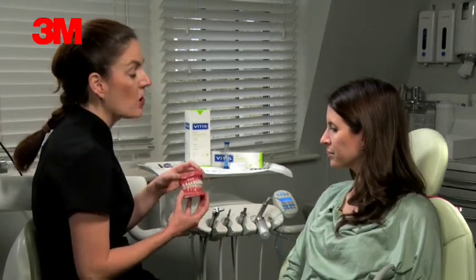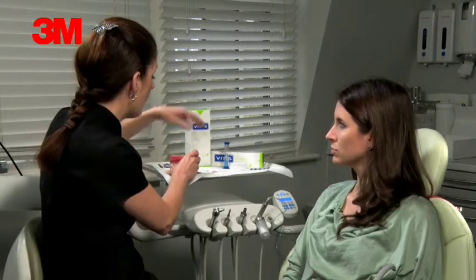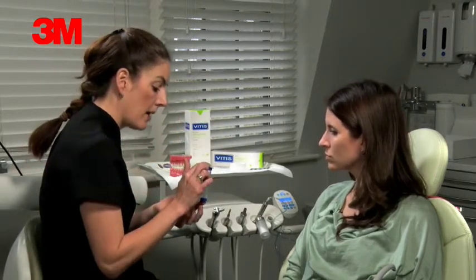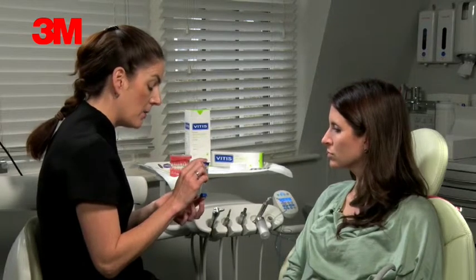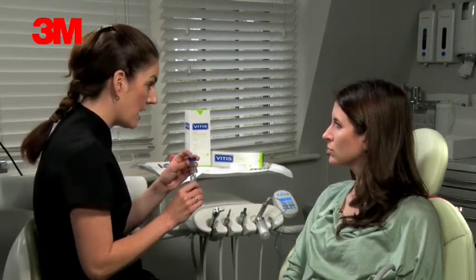It's actually going to take you longer to clean it now because there's a few more nooks and crannies. In the pack that we give you, there's a little timer — that's about two minutes. It's going to take you about five minutes to give it a good clean.